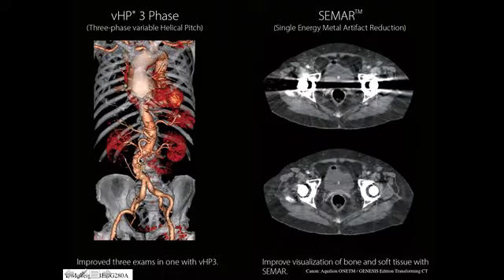And the great thing is if you're a surgeon and you're trying to figure out what you're going to do for this patient because they have this enormous aneurysm in their aorta. So this is their heart here. The contrast is in the left ventricle, and the contrast is also in their aorta. And you see the ascending aorta comes up here, the descending aorta comes down here, and this is about where their diaphragm is, and you can see this huge expanded aorta in this patient. Right? So it's completely dilated, and this is called an aneurysm.